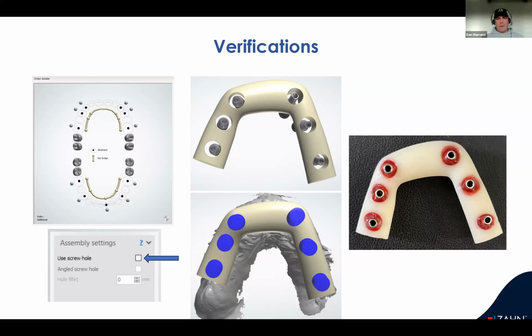I do them in a printable material to secure it really well, and do the opposite. How many people have had their jigs break because they're luted together? Now we do the opposite. We actually fill them in from the outside. We haven't had one broken. The passivity seems to be better since they're not luting sections together and they're just filling in holes. Works really well. And someone recently posted, how do I make a verification?